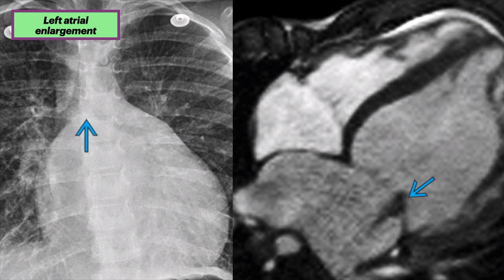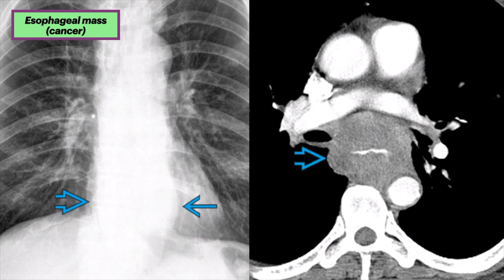This was overall consistent with dilated cardiomyopathy. Here is a case of an esophageal mass — cancer. The X-ray on the left shows abnormal convexity of the lower third of the azagoesophageal recess and a left retrocardiac mass-like opacity. This patient presented with severe dysphagia. The axial CT on the right shows marked circumferential mural thickening of the lower esophagus, producing abnormal convexity of the azagoesophageal recess.